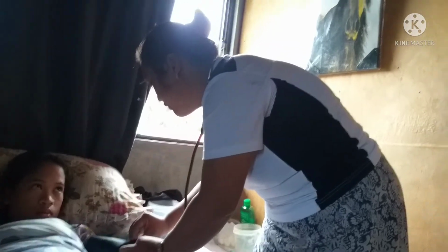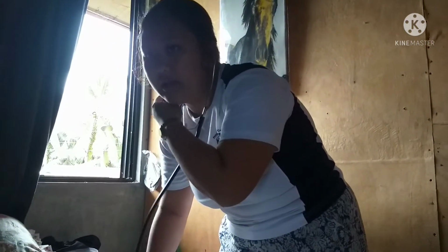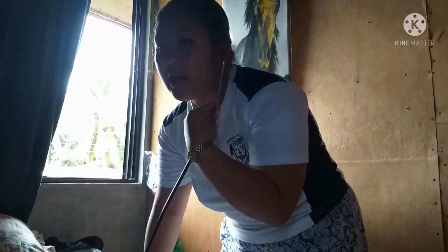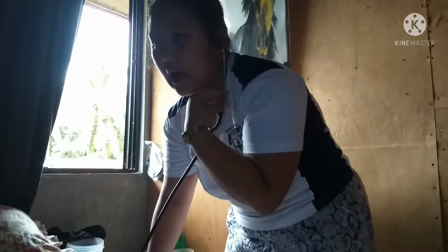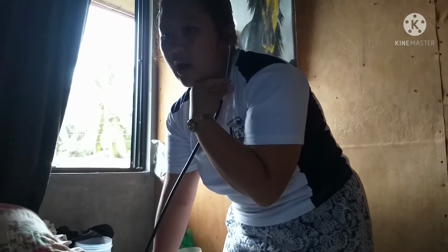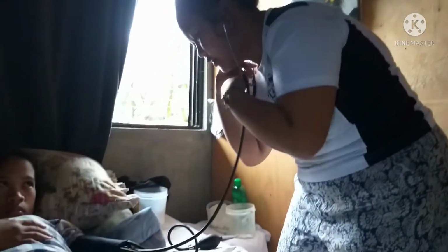Next, inflate the cuff until the pulsation disappears. Place the diaphragm of the stethoscope directly over the pulse. This will prevent you from missing the first sound as a result of the auscultatory gap, a period where no sound is heard. Gradually deflate the cuff all the way to zero, taking note of the first and the last clear sound.